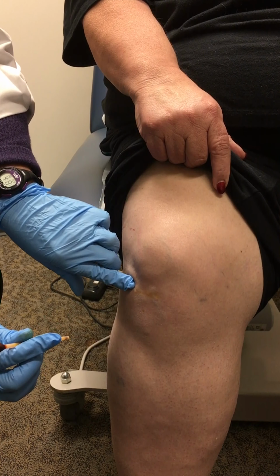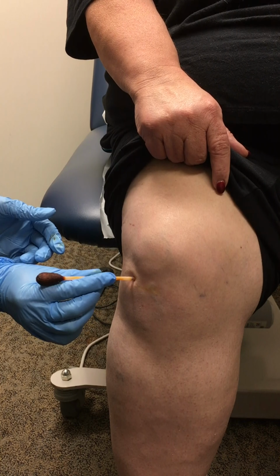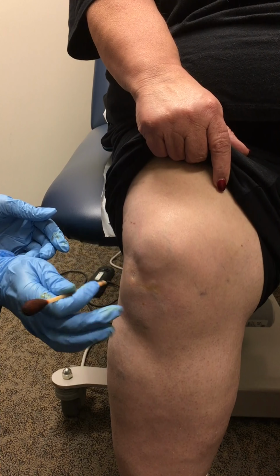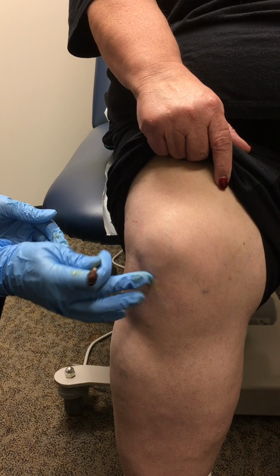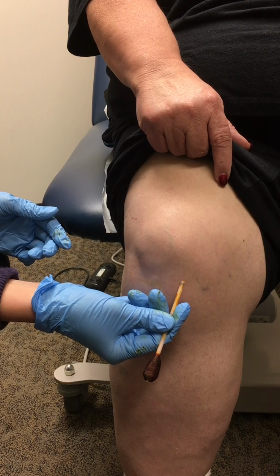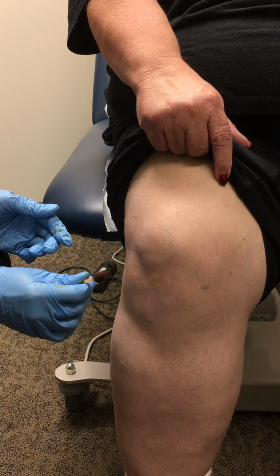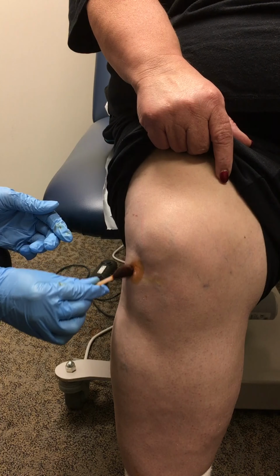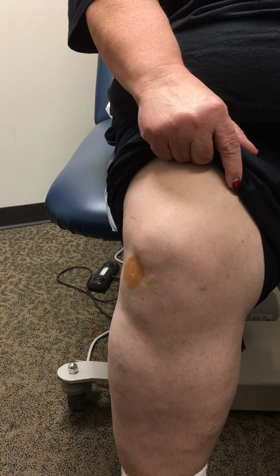And then I like to use the betadine stick to mark the spot. You can also use anything from a surgical marker to even a makeup pencil. And if you're first learning and a little bit nervous about the landmarks, you can even use that surgical marker or makeup pencil to draw your lines and look for that intersection spot. Can just give you a little more reassurance about where you're going.